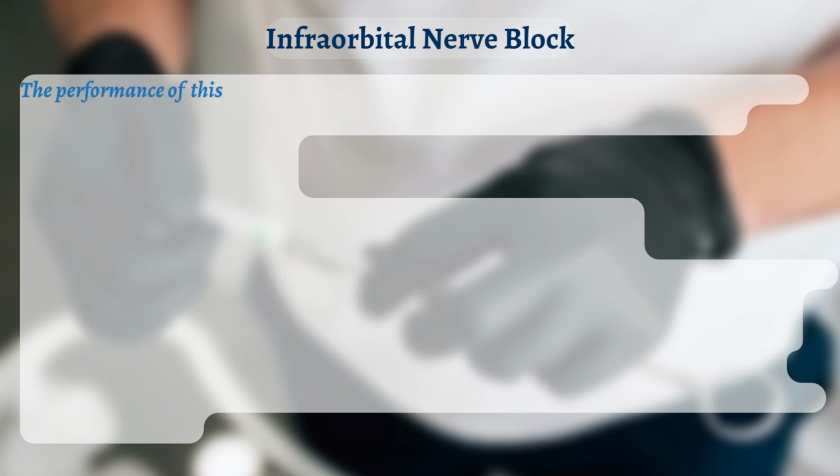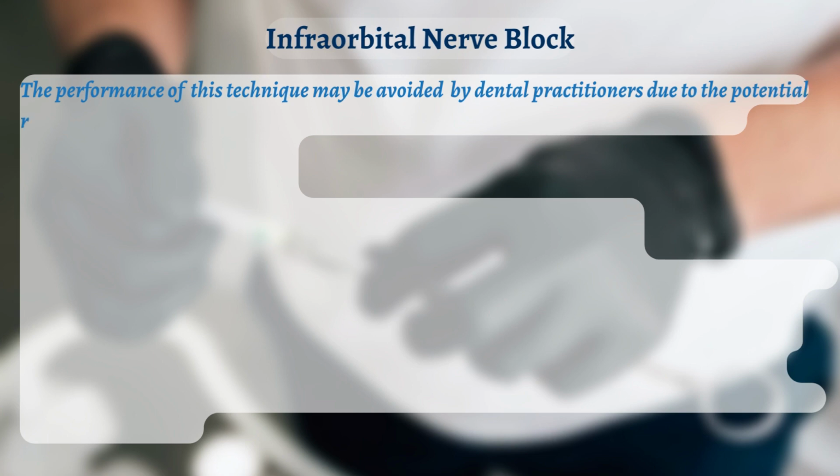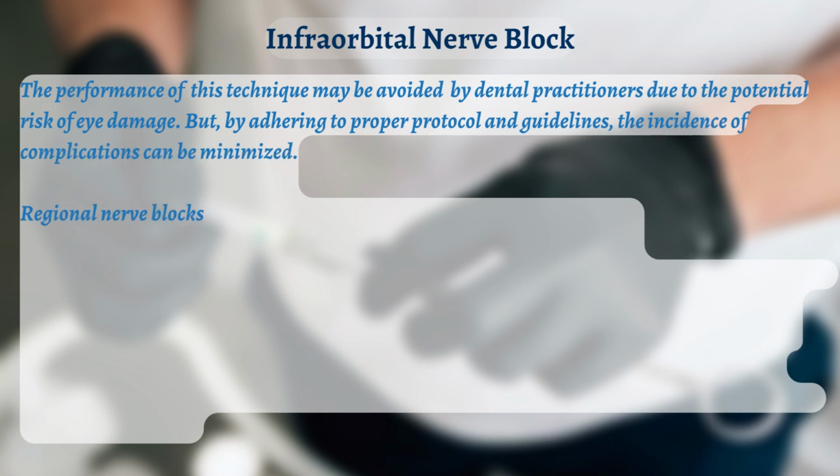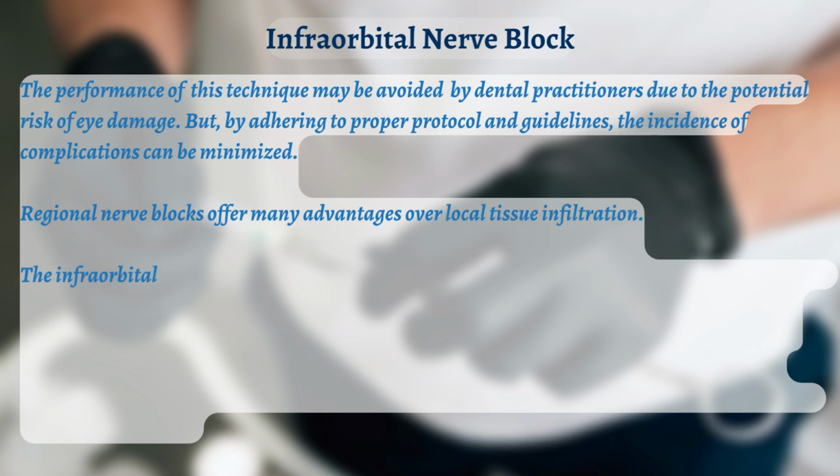Infraorbital nerve block. The performance of this technique may be avoided by dental practitioners due to the potential risk of eye damage, but by adhering to proper protocol and guidelines, the incidence of complications can be minimized. Regional nerve blocks offer many advantages over local tissue infiltration.